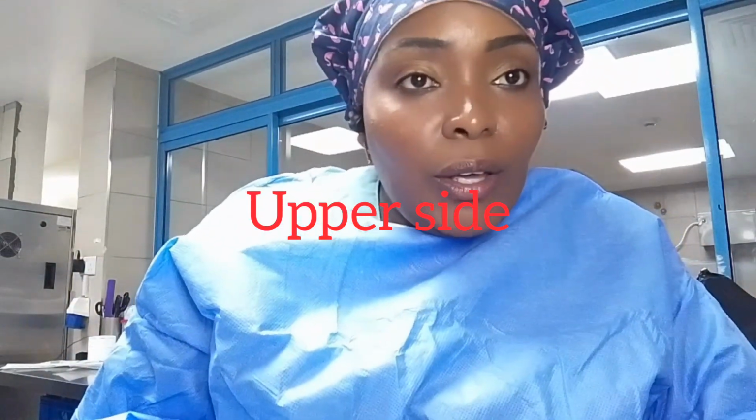That is the position we call the Trendelenburg position. After the patient is in Trendelenburg position, you turn the head to the side a little bit so that you can access the jugular side. That is in the case where you want to place your central line on the jugular.